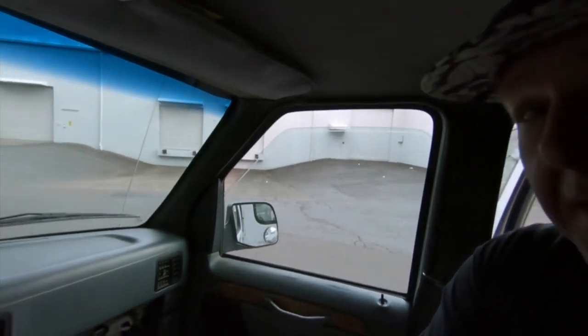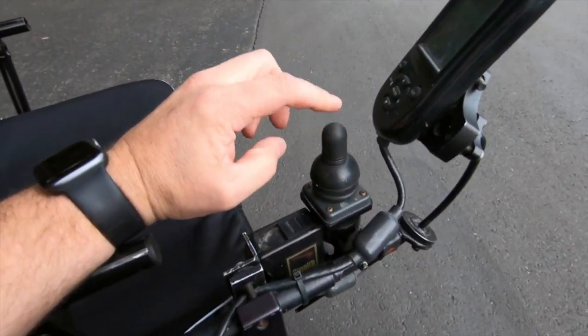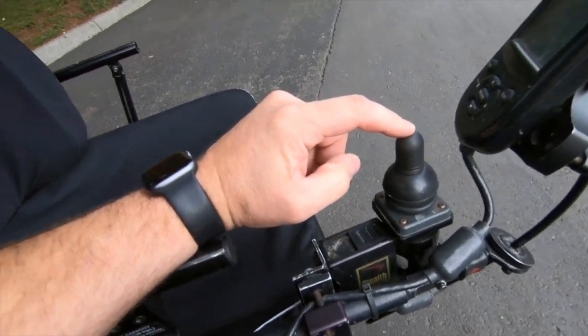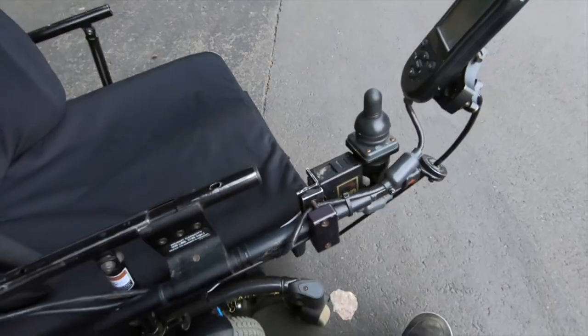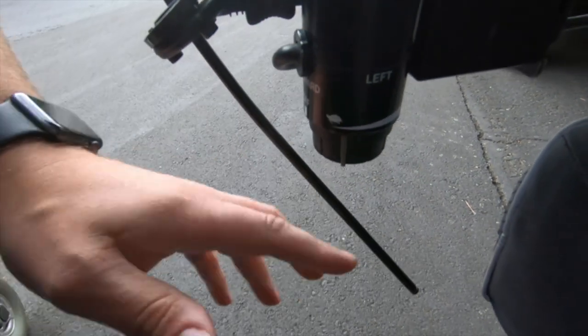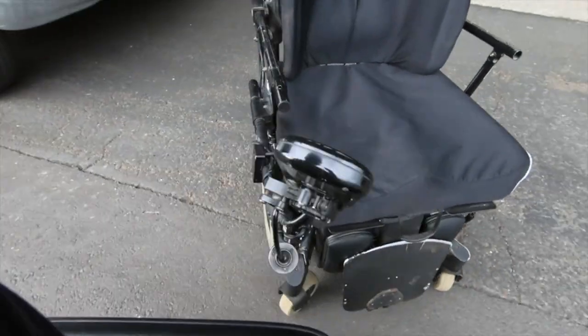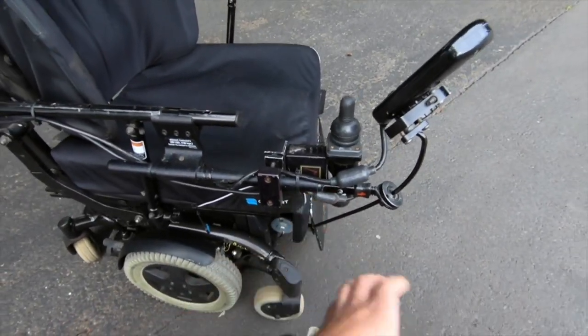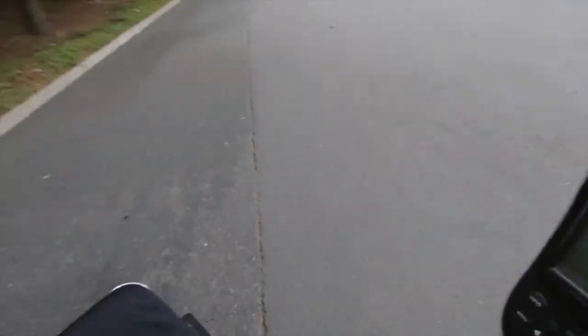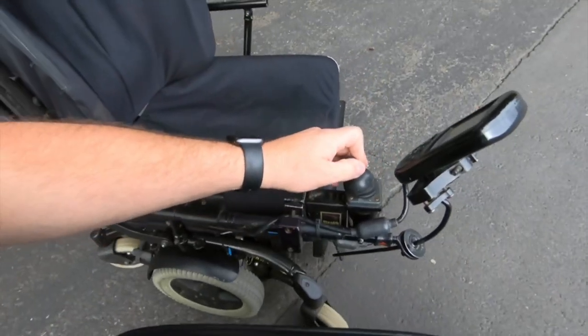We've arrived at a random industrial area. We've got some hills and things over here so that might be useful. By the way, it just barely fits through the door with this head array on there. Hopefully we won't make safety happen today, but it should be interesting nonetheless. One of the other things I did find out: you can independently adjust the profile that's used for this attendant control in relation to the head array. The way these work on these chairs is you have this knob on the bottom that you can turn and that enables the attendant control. Your speed adjustment is controlled by how far you turn this dial. That basically puts it into attendant mode and you can drive the thing with this joystick. Once you turn this off, it goes back into head control mode and you just have to push the reset switch.